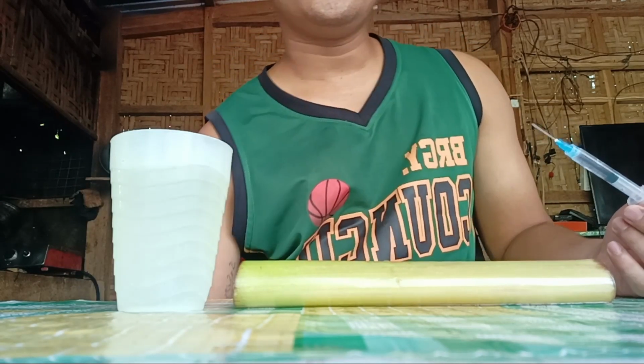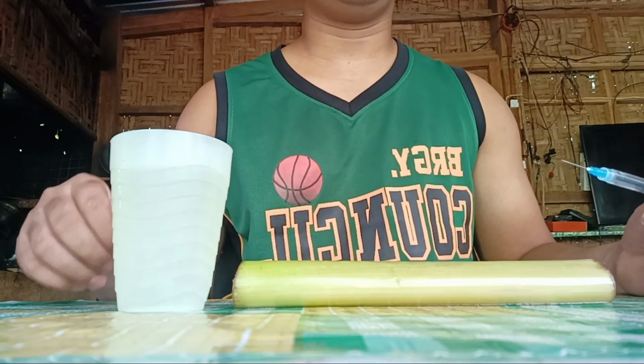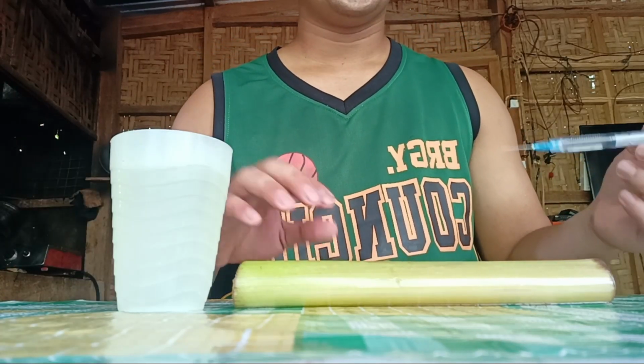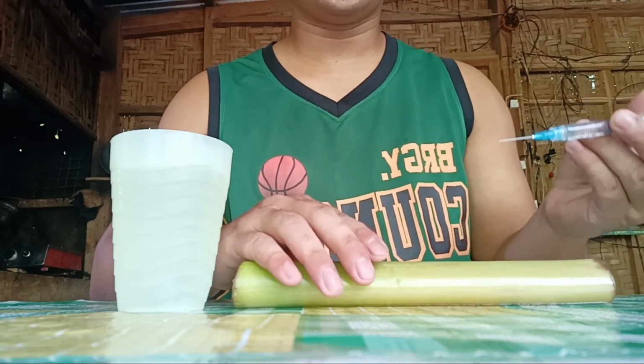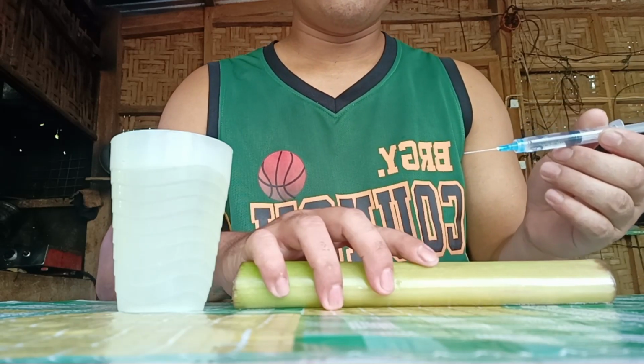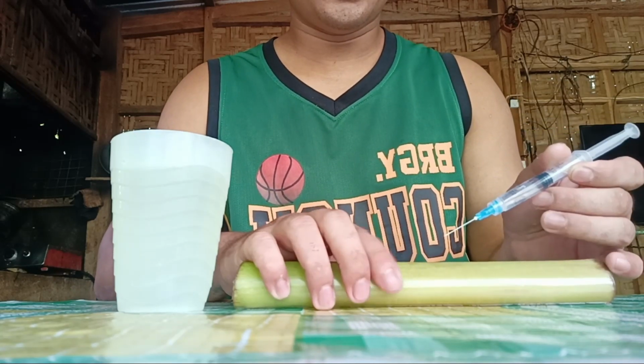Injecting intravenous injection, the target would be the veins. So you need to angle the syringe at 25 degrees. Massage before injecting.